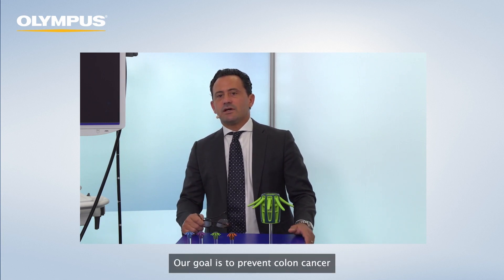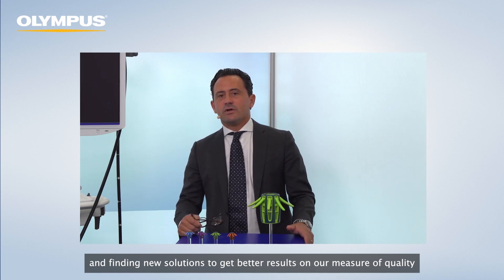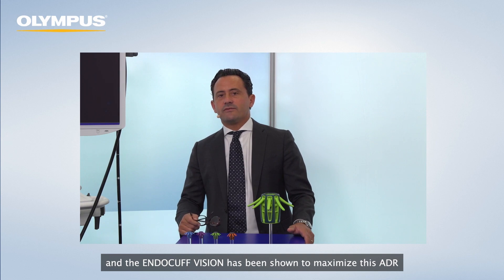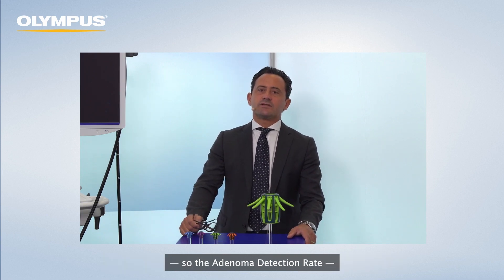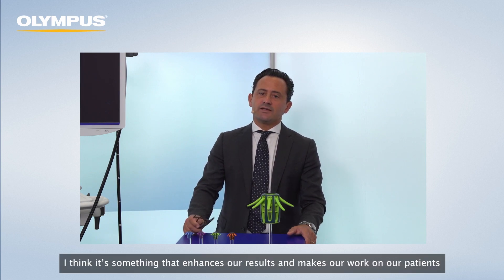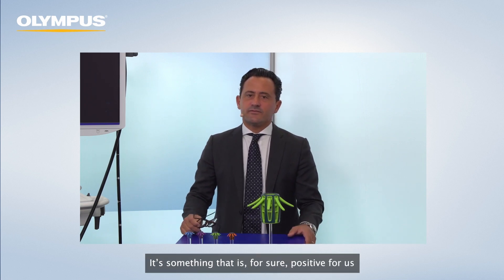What is our goal? Our goal is to prevent colon cancer. When we do screening or surveillance colonoscopies, there has been a fair amount of work on finding techniques and new solutions to get better results on our measure of quality. Our measure of quality is the adenoma detection rate, and the Endocuff Vision has been shown to maximize this ADR, as well as the polyp detection rates. It enhances our results and helps us find and prevent colon cancer.